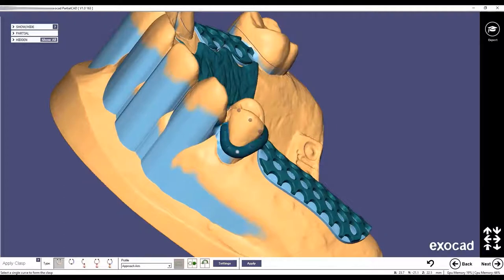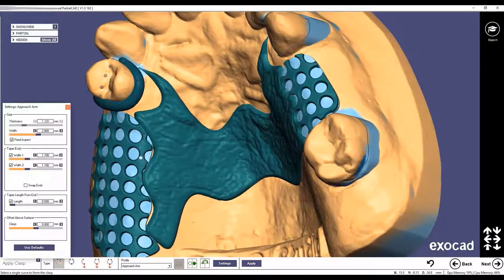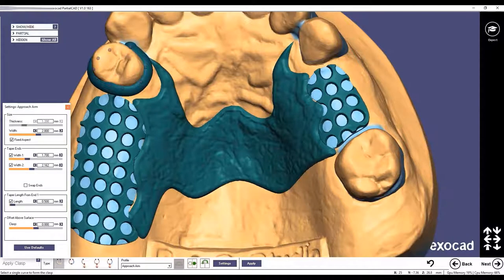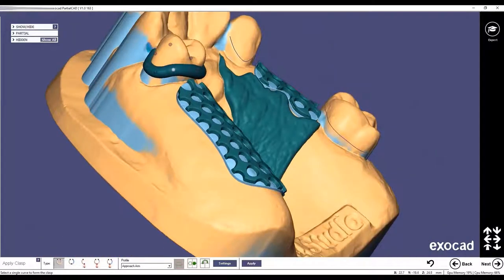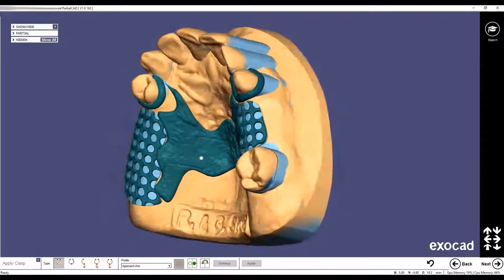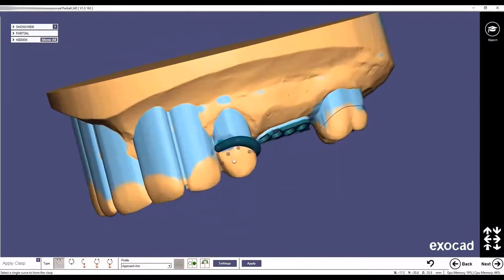And I enlarge the final part. Enlarge the width. Same thing with the canine. In this case, the clasp is very, very high. I could use an anterior clasp, but the approach arm, I like it better.